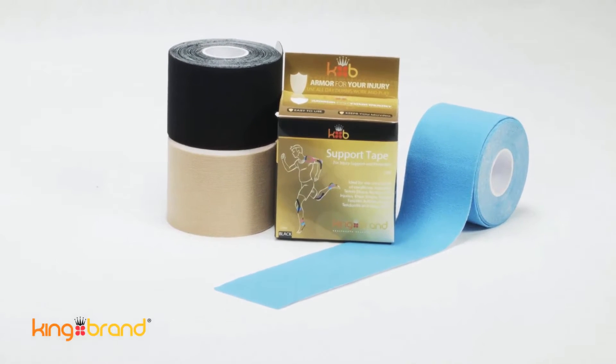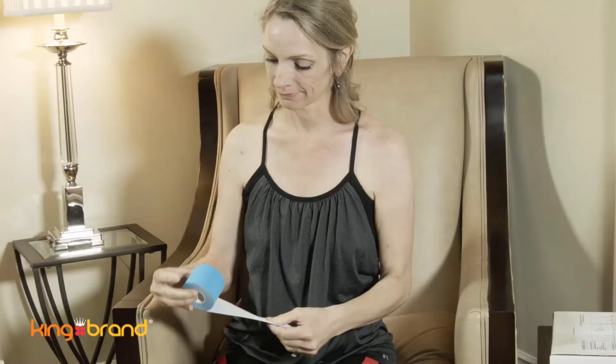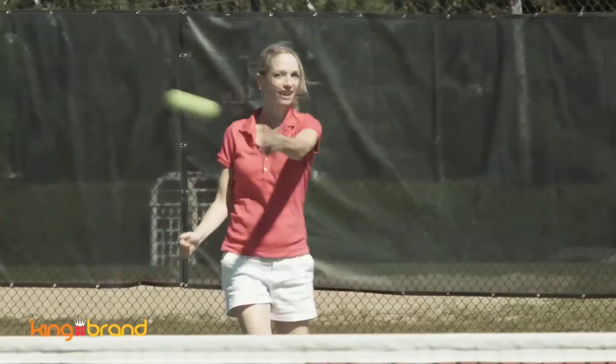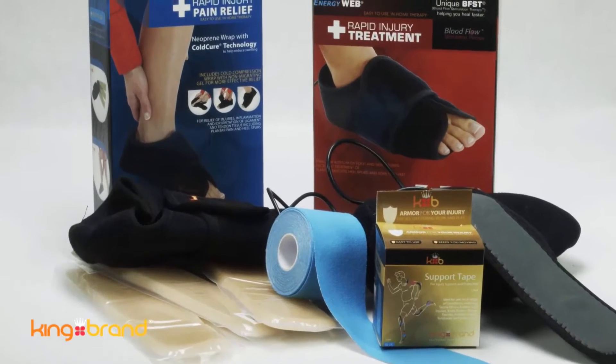Thank you for purchasing King Brand Healthcare Support Tape. King Brand Support Tape is a medical grade tape that is designed to be worn during physical activity, at work, and in between other therapies such as cold care or BFST wrap treatments.